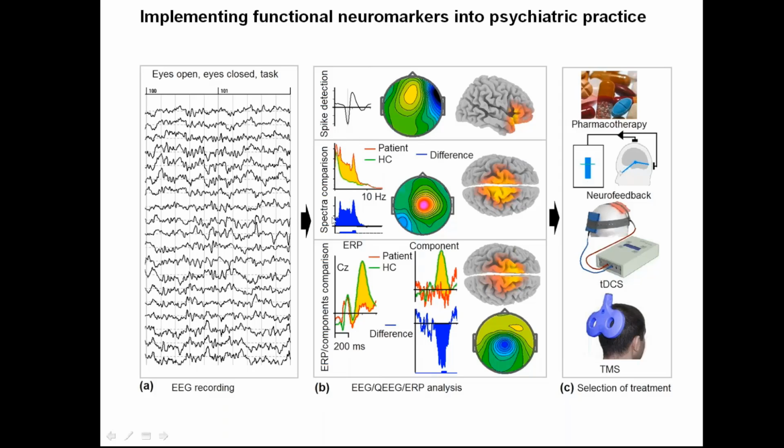The next step, of course, is to compute EEG spectra in eyes open, eyes closed, and task conditions, and compare with norms. It gives you information on how the cortex is regulated in this particular subject. In this analysis, you rely on data that are known, say the theta-beta ratio, excessive frontal midline theta, or excessive alpha activity.